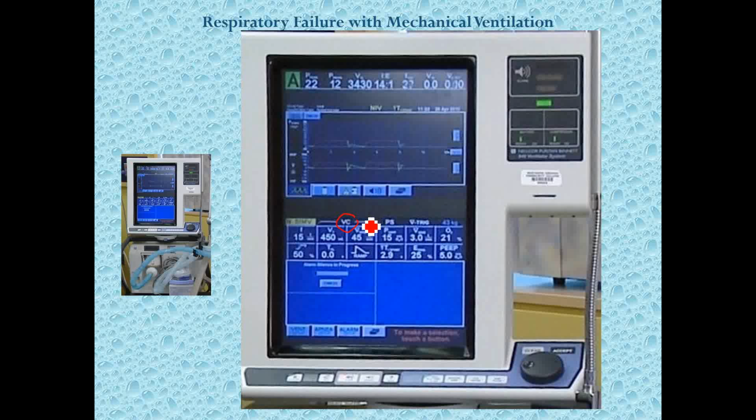Now, in your notes, I did review the differences between the two. It is very rare that Dr. Reed would ask which is which, and it is definitely inappropriate for the nurse to decide which is which as far as prescribing a ventilator volume delivery system. The physician is going to be the one that determines whether the patient should get tidal volume delivered by volume control, or by pressure control. You just need to know that there are a couple of different options for the tidal volume to be delivered to a patient.